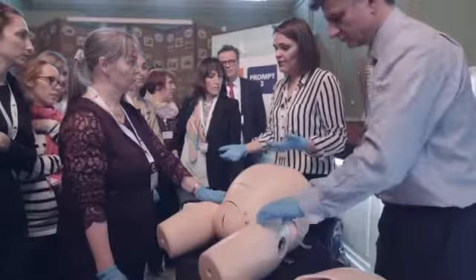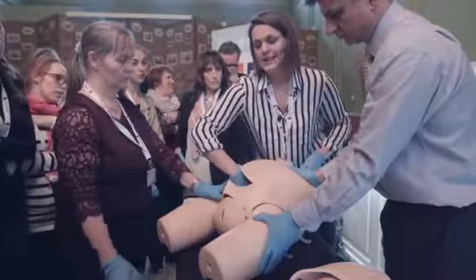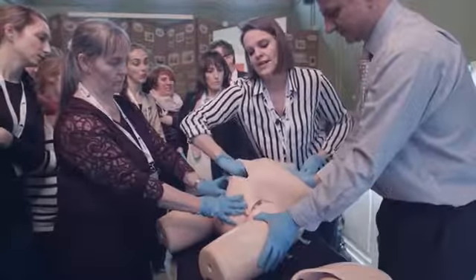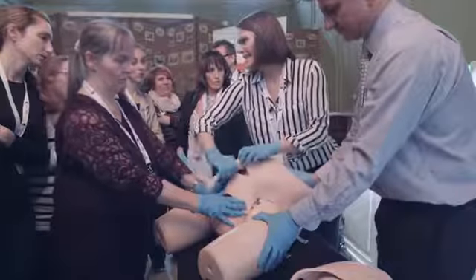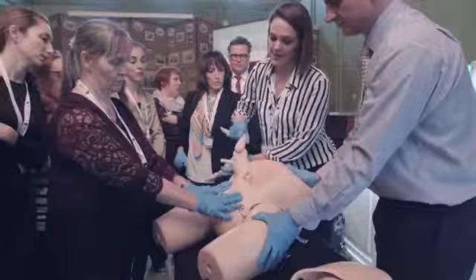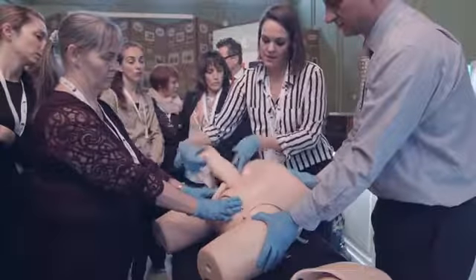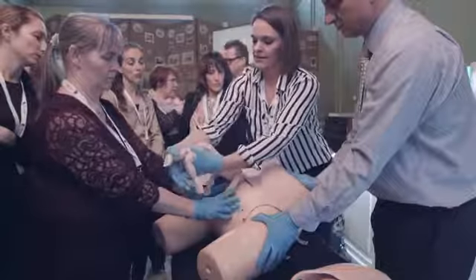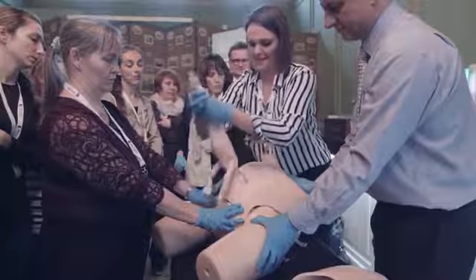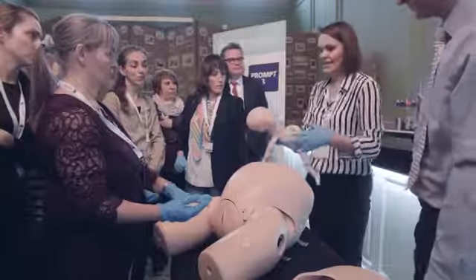So say that's failed, or we want to try reverse breech extraction first. It's also really great for trying that. So I can feel I've got a hand there, so I don't want to get that. And then, there we go, I've got a foot. And it's slippy, it's quite realistic, simulating it. So there we go. So I can practice the rest of my delivery. There we go. Again, hopefully when you're practicing it, you're not doing it from behind the baby like I am now. There we go, great. So there we go. So you can practice the manoeuvres really nicely, and also with the skin off.